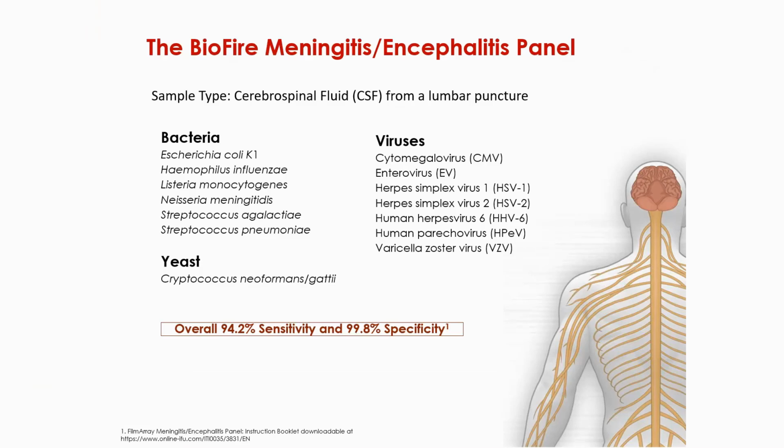One of the things that we'll always remind people is that, listen, these are the pathogens on the ME panel, right? And these are the most common pathogens that we encounter, right? So if the ME panel is negative, it doesn't mean that the patient doesn't have meningitis. That's one of the key education points that we stress, right? Here are the most common pathogens. If the ME panel is negative and doesn't identify these pathogens, that's all it's saying. It doesn't identify these pathogens, right? So we have to now look for other pathogens and manage this patient appropriately in that sense.